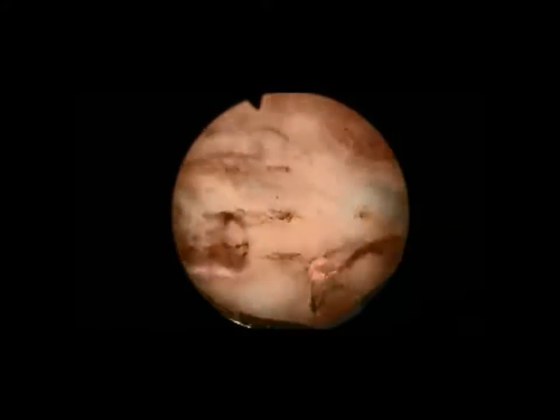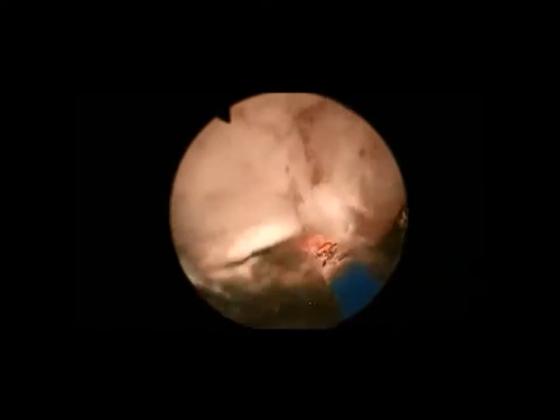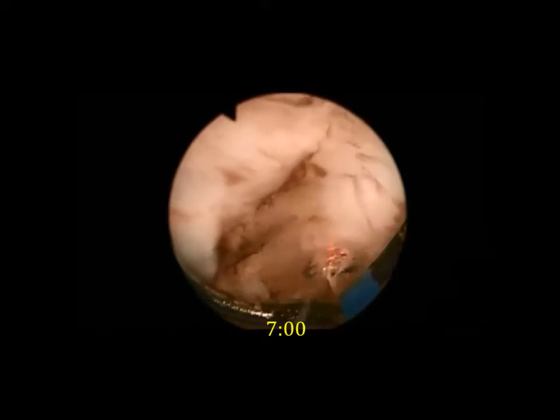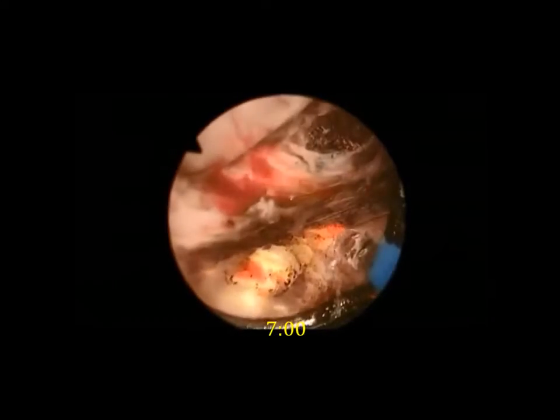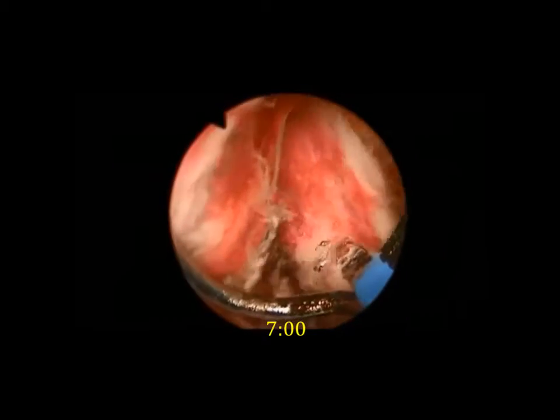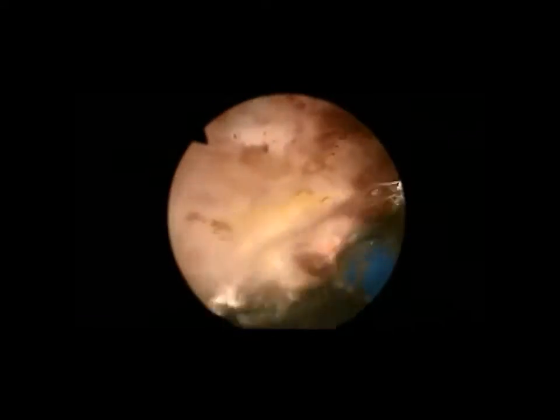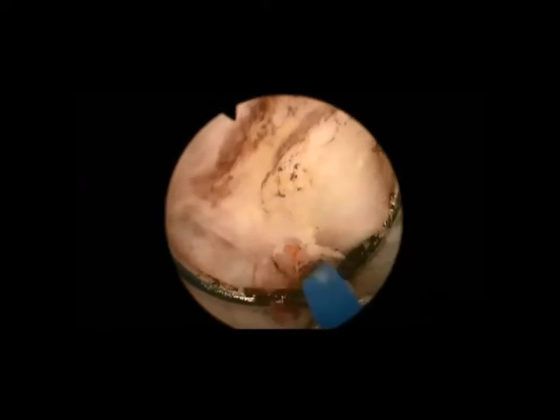In this case, we're going to complete that 7 o'clock incision, working from the posterior space and incising that adenoma against the capsule. This will complete the 7 o'clock incision and allow us to work from medial to lateral, undermining the adenoma from that 7 o'clock incision.